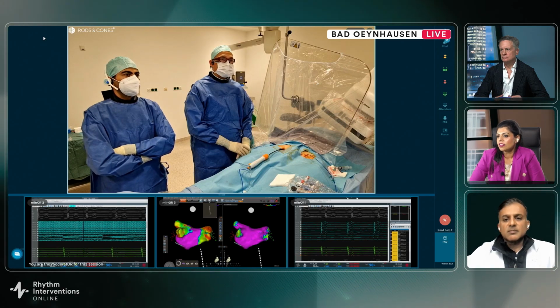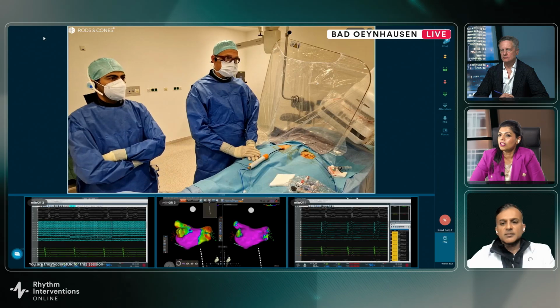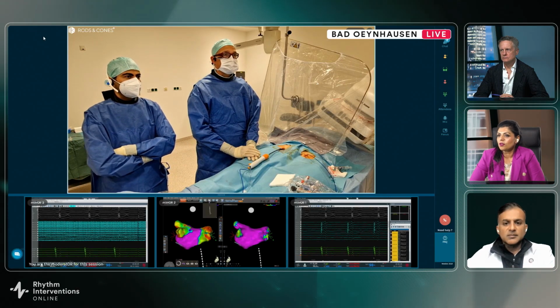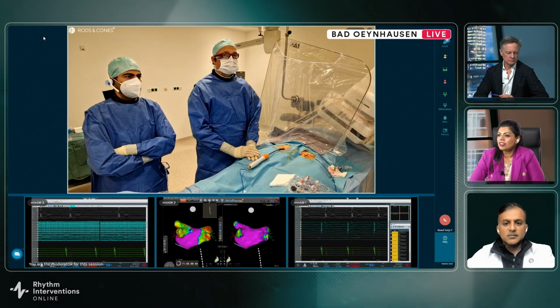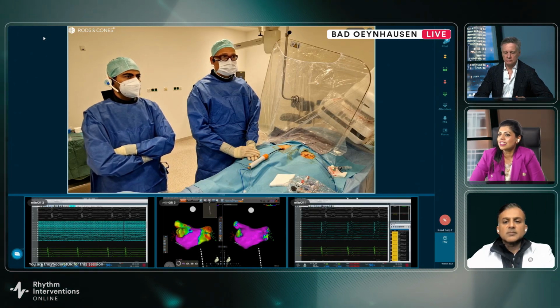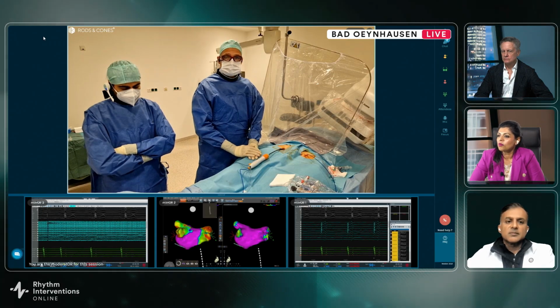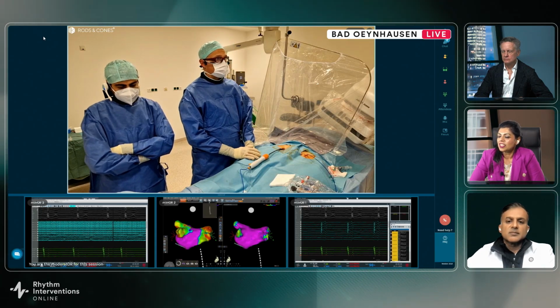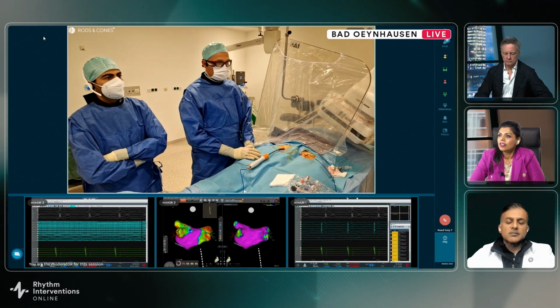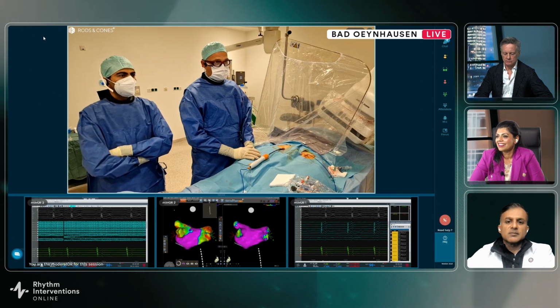There definitely was a slight concern in the beginning, but everybody was going for a single transseptal straight with the Visigo. You're in the left atrium before you know it. You're getting ready to apply because you're using the same catheter to map and ablate. So you get to the atrium quick. You're ready to ablate quick. I don't think many of us waited long enough to get that ACT high enough. And I think we learned it the hard way, is what I would say.